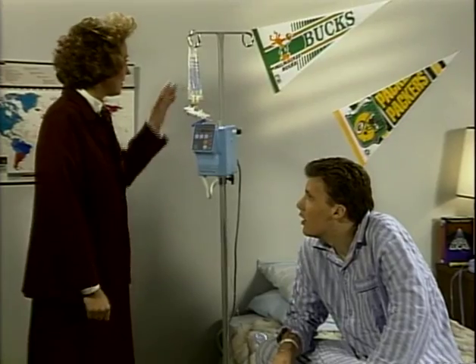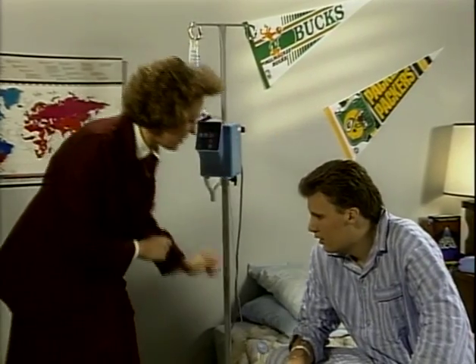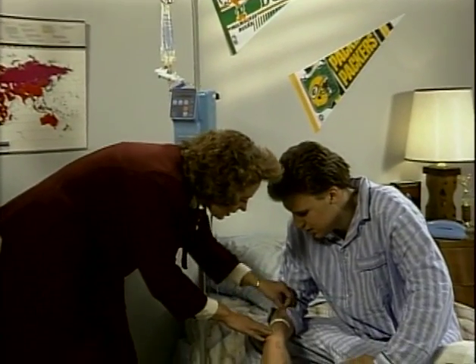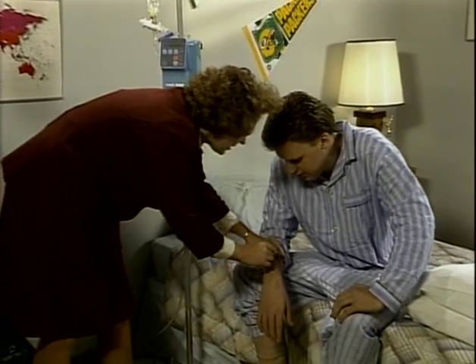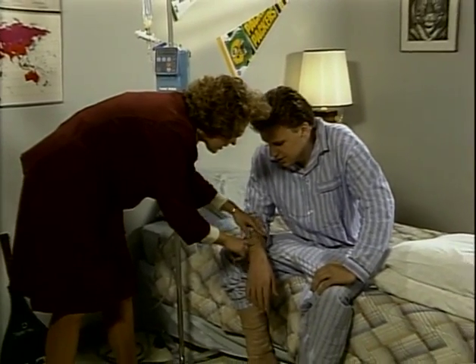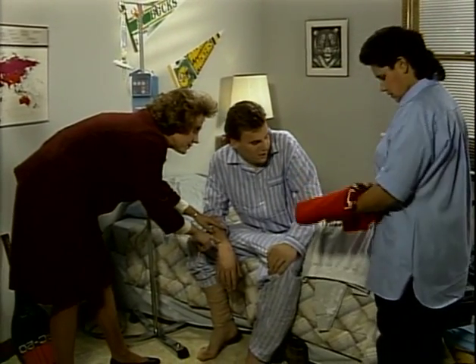With careful planning and management of time, Norma has completed the assigned duties safely and efficiently, just in time for Nancy's arrival. Nancy will disconnect the solution and cap the line. Then Norma can assist John to put on clean clothes. The role of the home health aide or caregiver goes beyond the personal care of the patient. There are measures you can take which are important for patients on infusion therapy.